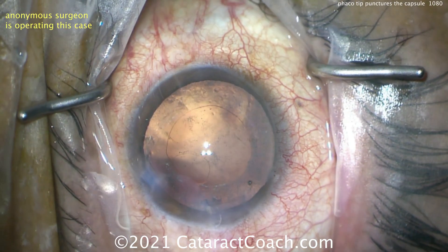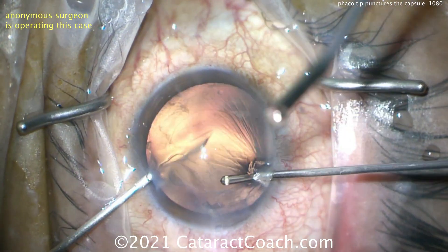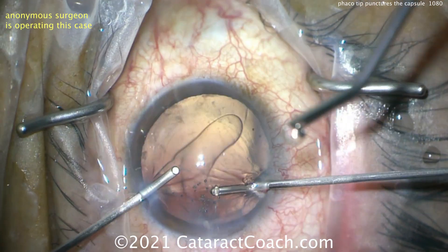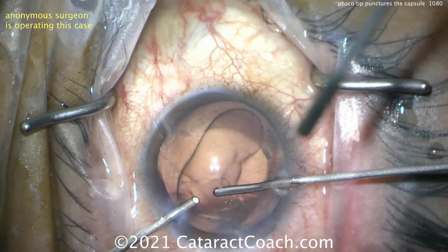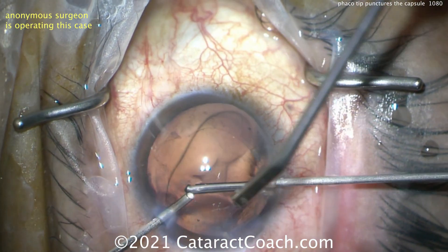You came out of the eye and let vitreous prolapse. So make another paracentesis — you're going to have to do an anterior vitrectomy. Go in that hole. Luckily the phaco tip made a nice round simple hole that has some structural integrity. So doing a bimanual anterior vitrectomy — there's no cortex.